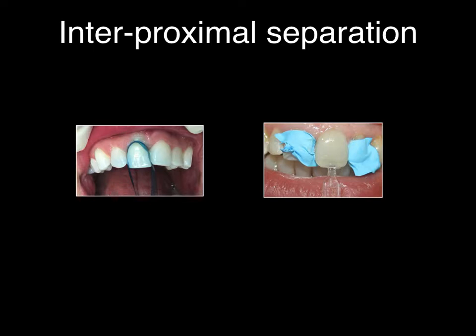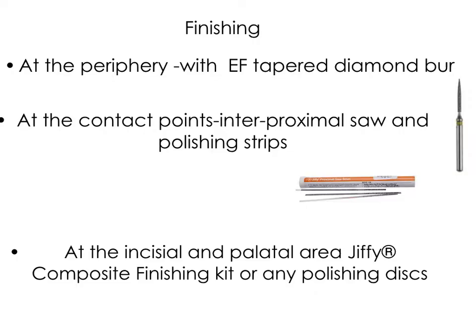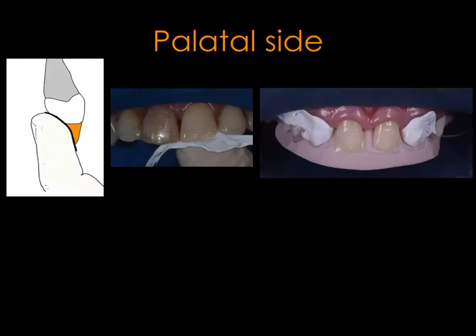For the interproximal separation, you can use, as I said, the Teflon or the cellulose strips. And for finishing, I like to use the extra fine diamond burrs for the periphery, in the contact point, interproximal, and then the polishing strips, and the incisal and palatal area. We can use the Jiffy composite finishing kit by Ultradent or any other polishing disc you have at your clinic.